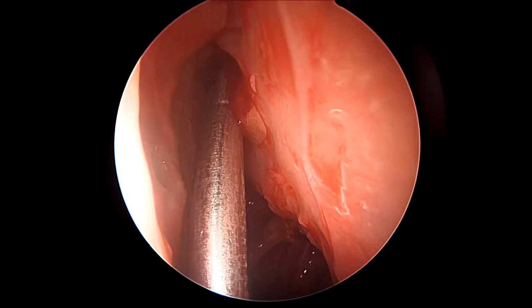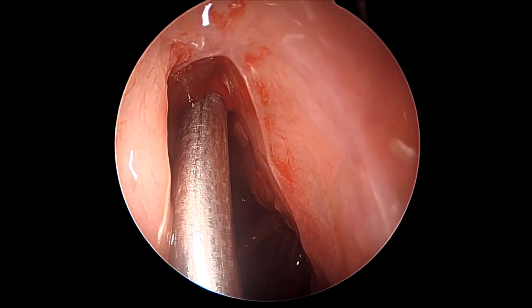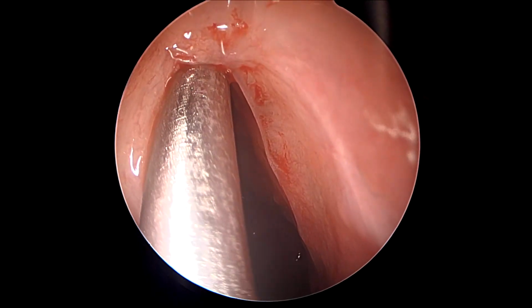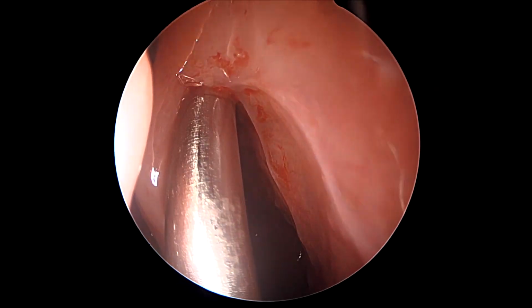As you see here, we are normally not very keen to remove the middle turbinate in revision surgeries, because it does act as a very important landmark for us throughout the surgery in navigating our way towards the ethmoids as well as the frontal sinus region.